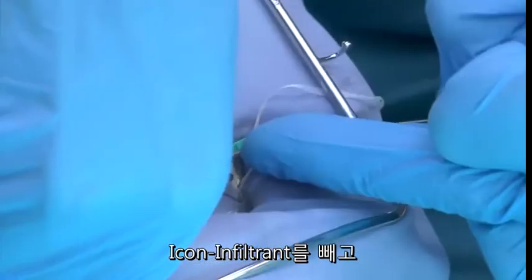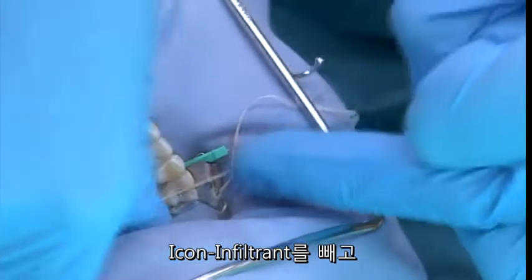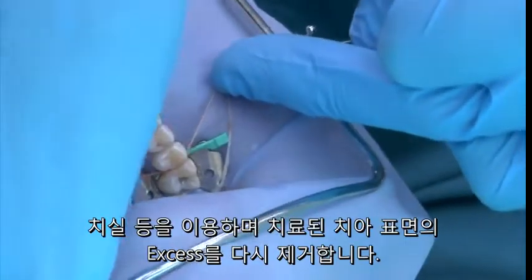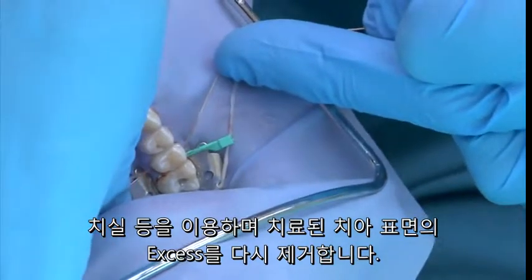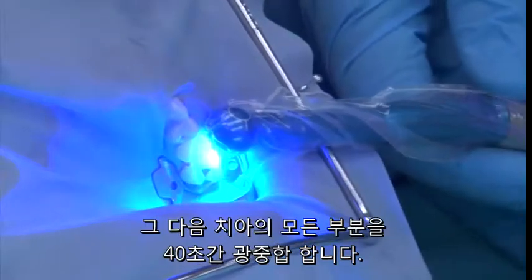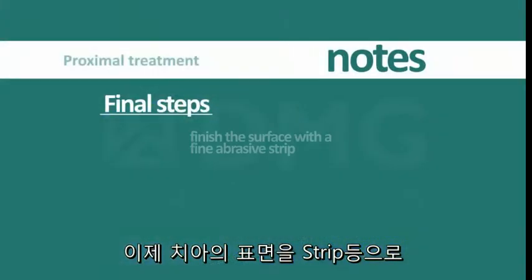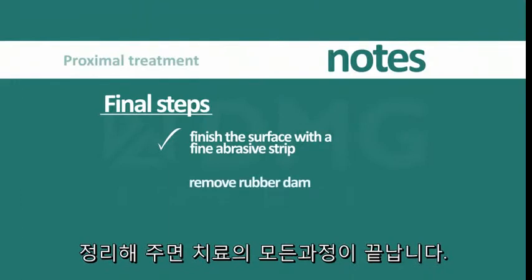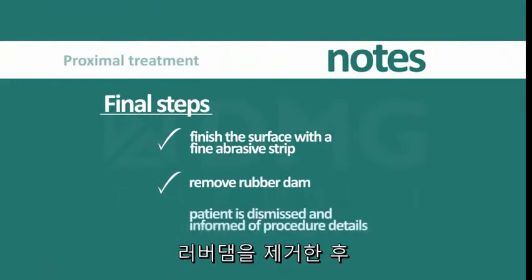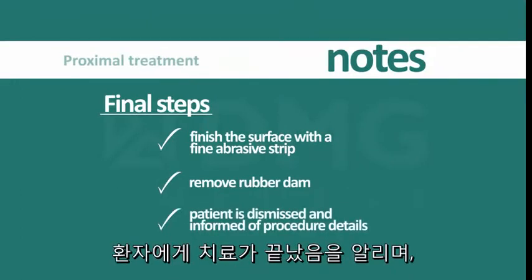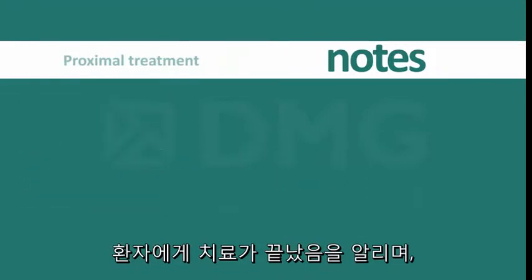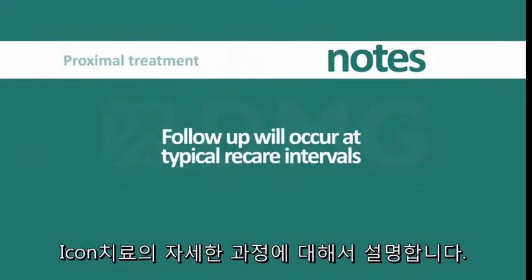Remove the proximal tip from the treatment area and floss once again to remove excess material from the surface. Then light cure all areas for 40 seconds. The surface is now finished with a fine abrasive strip. After removal of the rubber dam, the patient is dismissed after being informed of the details of the procedure performed. Follow-up will occur at typical re-care intervals.